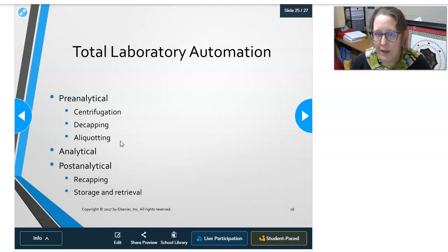Well, if you don't have one of these automated systems, then you have to look through all the specimens that you've run for that day one at a time to find that specimen, to make sure that you don't pick up the wrong one, you don't misread the name, and you have the right one that was collected at the time, maybe it's the morning run or whichever one you want to add the test to.